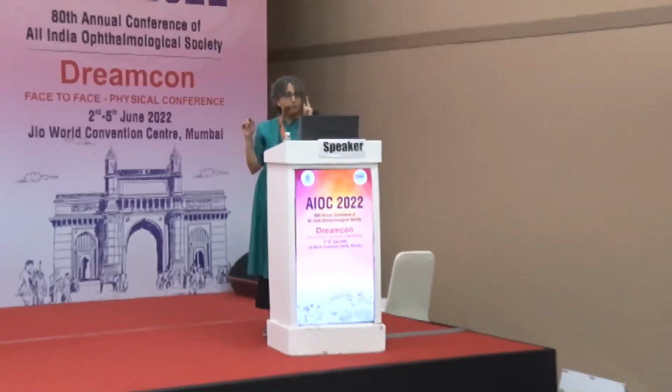What is the standard procedure for when you take an applanation or a... Applanation. Our NCT is more for screening the routine patients coming in. Any patient who's coming to the glaucoma department goes through AT. And any patient who's crossed over to the glaucoma department, either from other departments or on routine screening being detected for glaucoma or family history, 100% applanation, except for situations where we can't do it. Of course, tonopens and other things come into play, but 100% applanation.